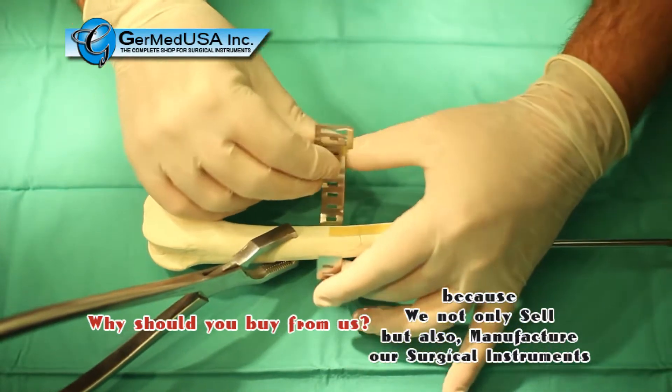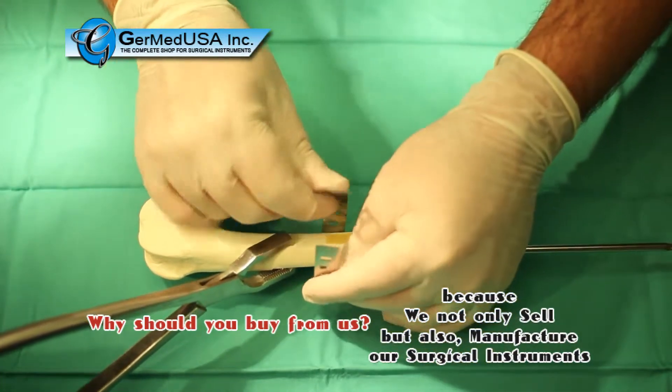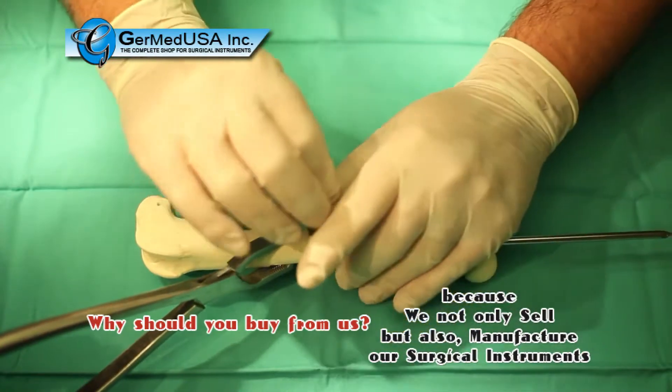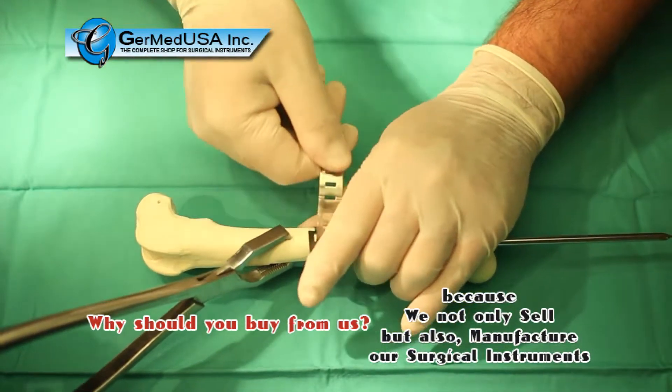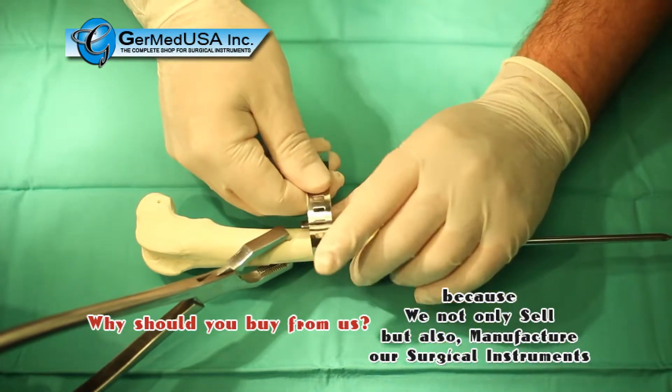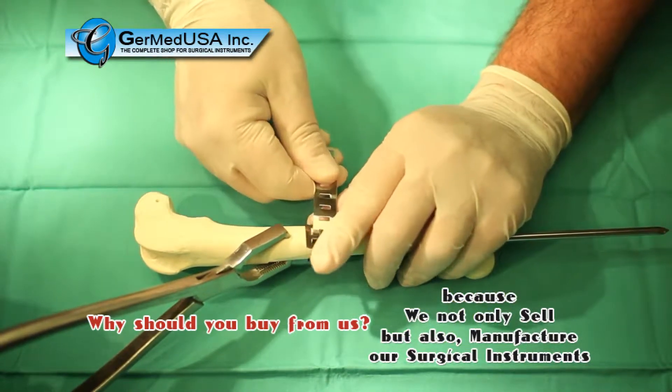With the QuickLock Circlage Band in place, the leading end is passed through the tapped portion of the buckle and pulled hand-tight to position along the fracture. Because these bands are self-retaining, it allows for pre-placement and optimal positioning along the fracture site before final tightening.